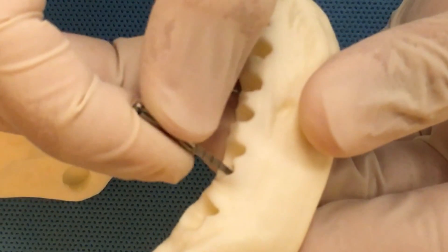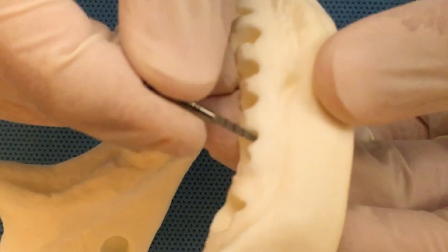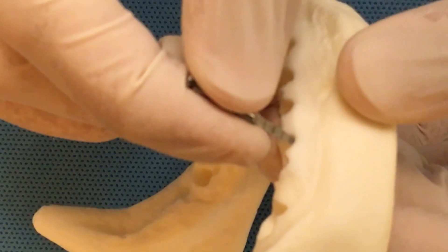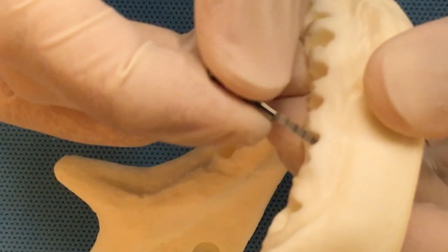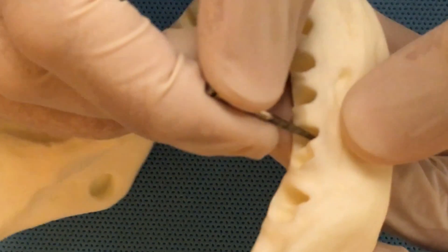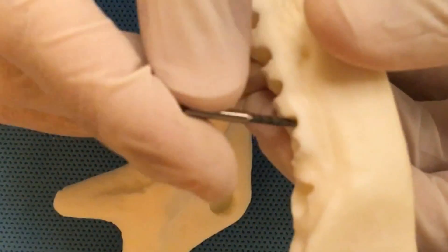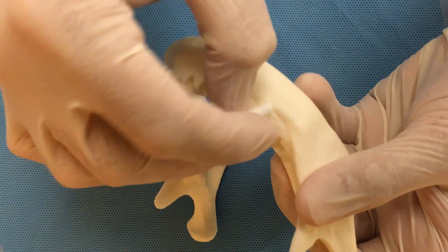We want to check if it's the distal root or the buccal root. We can see that, counting from the last coronal line — 16, 14, 12, 10 — the buccal root measures about 10 millimeters in length. We will try to drill two extra millimeters, so we will drill 12 millimeters, and this is going to be our reference point.